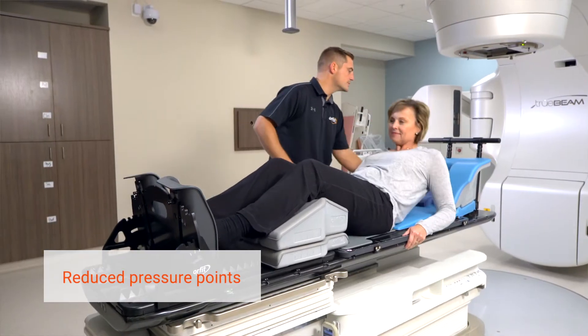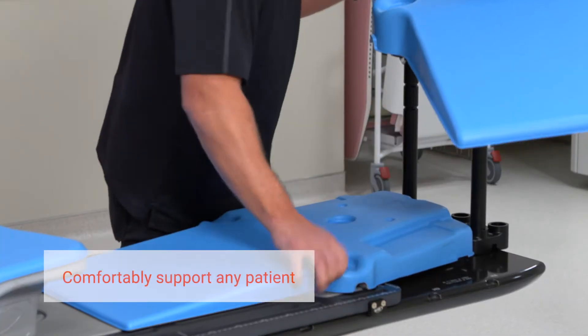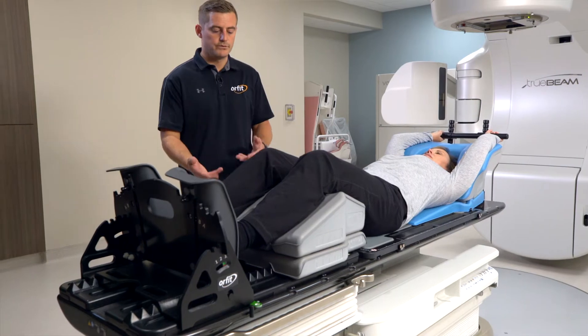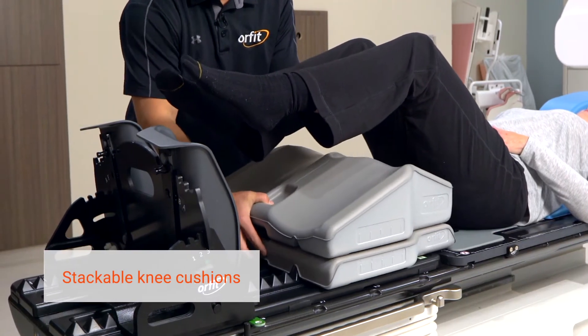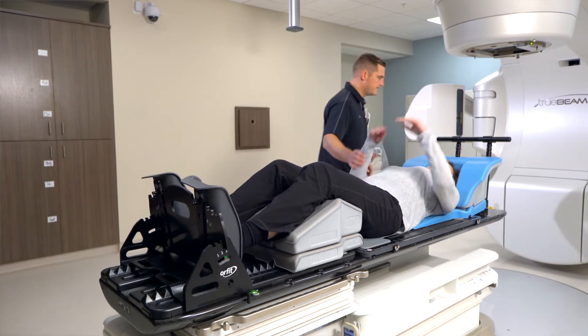We also have other cushions for different heights you're trying to achieve, so you can go to a 5-degree cushion, 10-degree, or stack those and achieve a 15-degree incline. We also have three different options for knee supports as well, so these cushions stack and they can achieve different heights for whatever your patient needs for comfort.